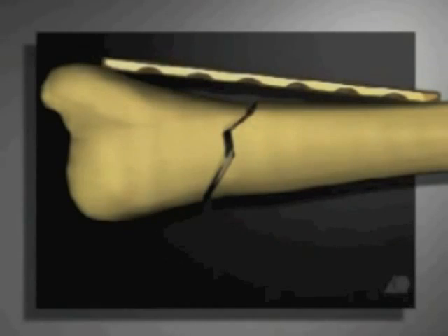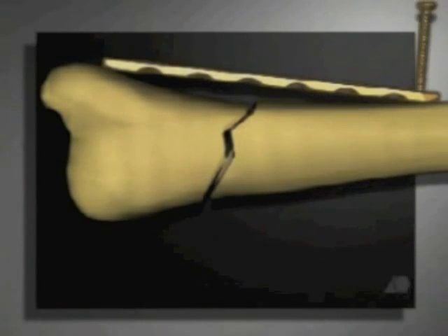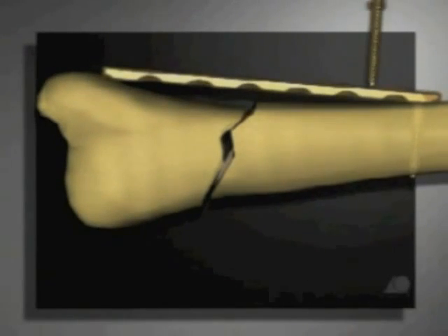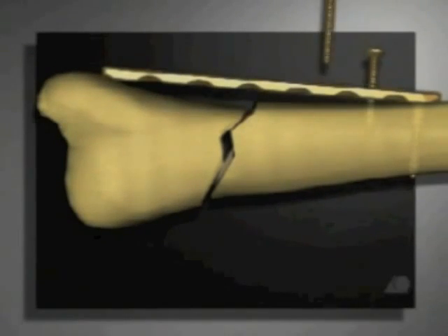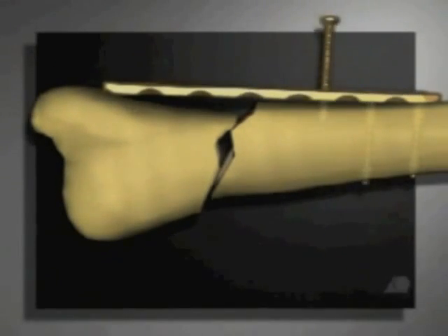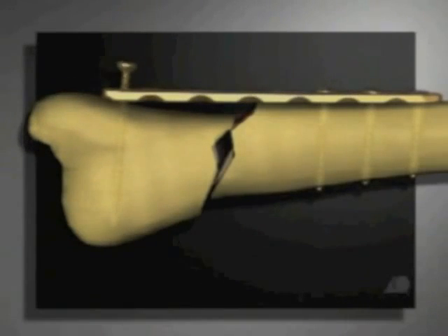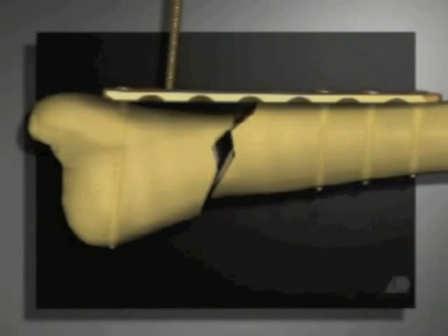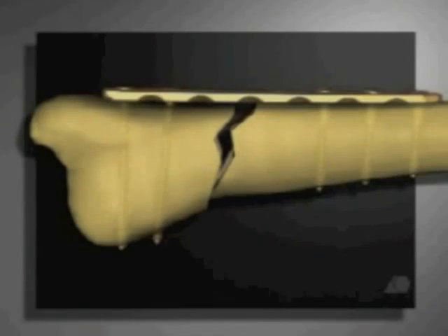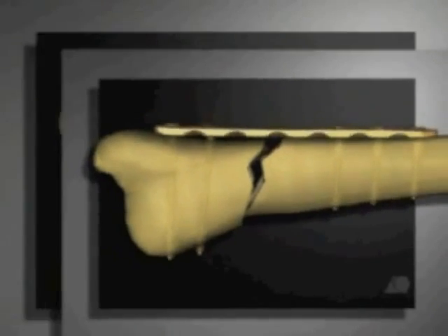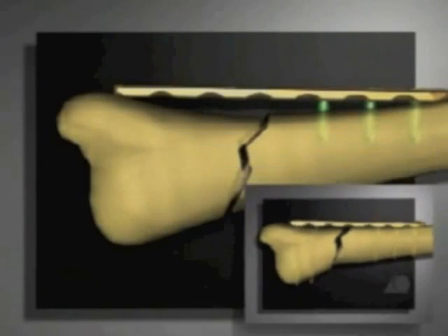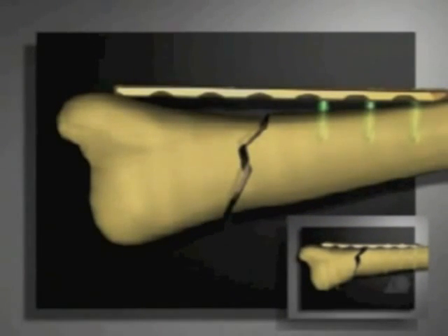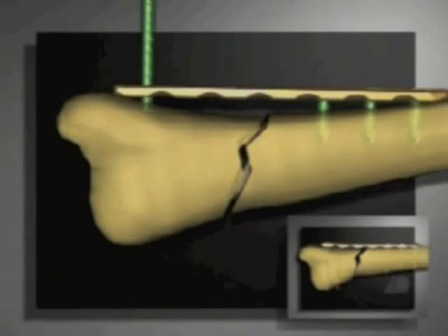Here an inadequately contoured LCP fixed in a conventional way is shown. When the last screws are tightened into the poorly contoured plate, the fracture dislocates.